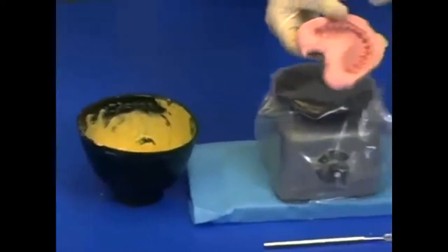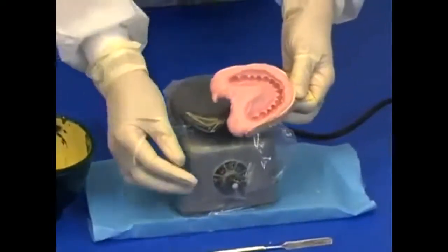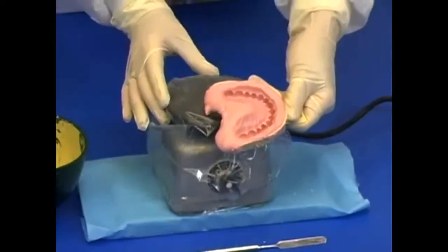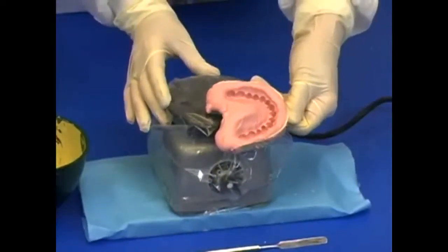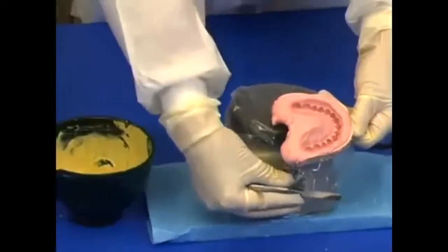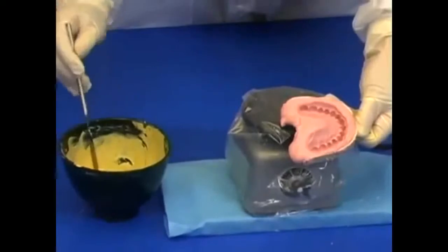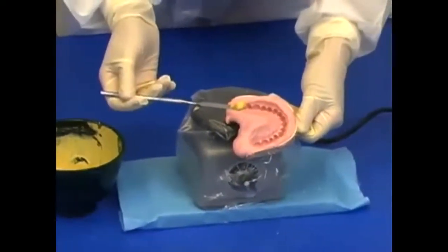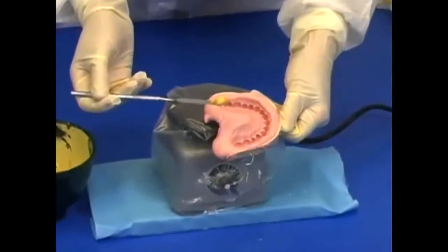Holding the handle of the impression tray, place the tray onto the surface of the vibrator. Angle the tray with one posterior edge touching the vibrator. Pick up a pea-sized increment of stone on the end of a small spatula.